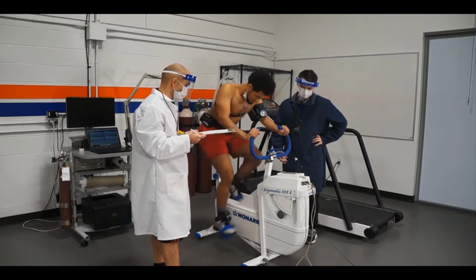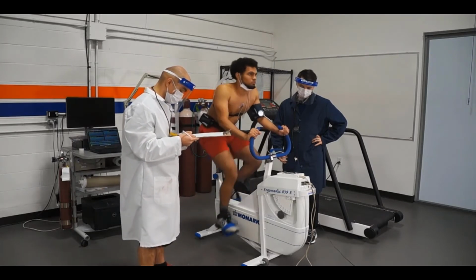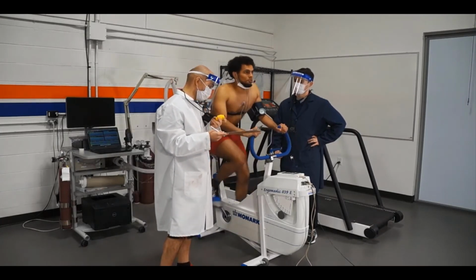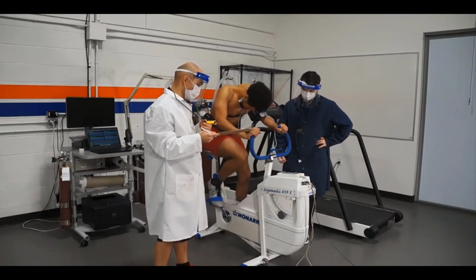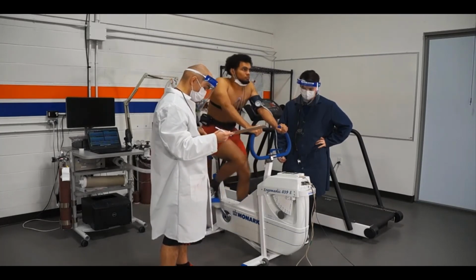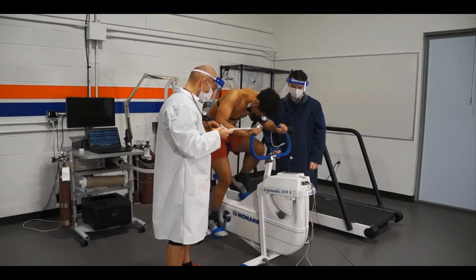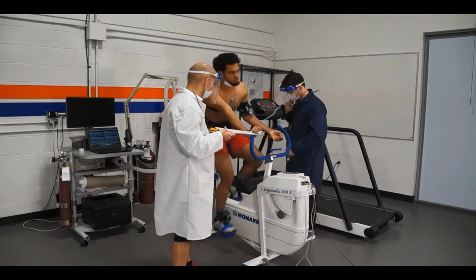They're not steadily increasing their heart rate, but there are tests, especially on an electronically braked bike, that you can do, and I've done one where you increase 1 watt every 2 seconds. So 30 watts a minute, but it's a very gradual hill climb, like the exact same slope, and it's just gradually getting harder and harder. There is no incremental increase in the workload. That can really fry some people's legs, especially on a bike.